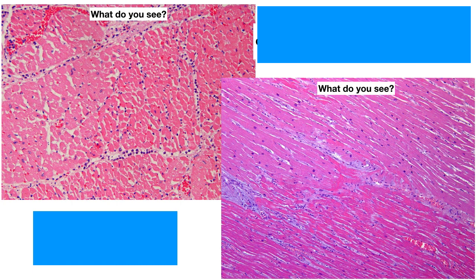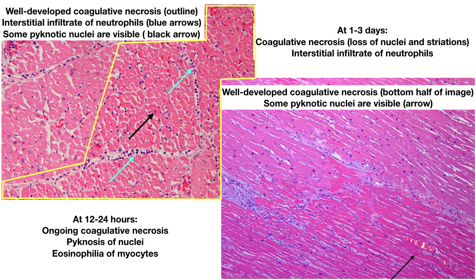On the top left, there is well-developed coagulative necrosis, outlined with the yellow arrow on the right side. There are still some visible faded pyknotic nuclei, and there is an interstitial infiltrate of neutrophils seen at the blue arrows. In the bottom right, you see well-developed coagulative necrosis in basically the bottom half of the image, with pronounced hyper-eosinophilia of the cardiac myocytes and essentially loss of nuclei, although some very faded ones remain. At 12 to 24 hours, you see ongoing coagulative necrosis, pyknosis of nuclei, and eosinophilia of myocytes. At 1 to 3 days, you see coagulative necrosis, loss of nuclei and striations, and interstitial infiltrate of neutrophils.